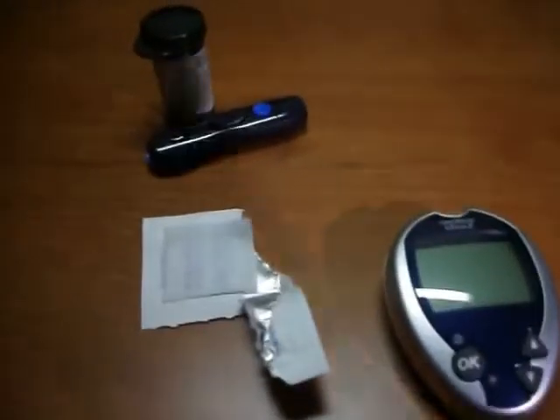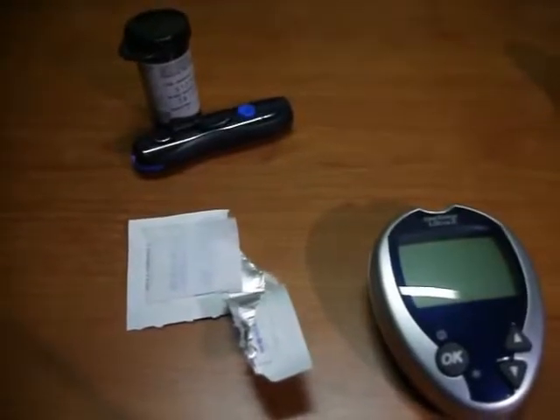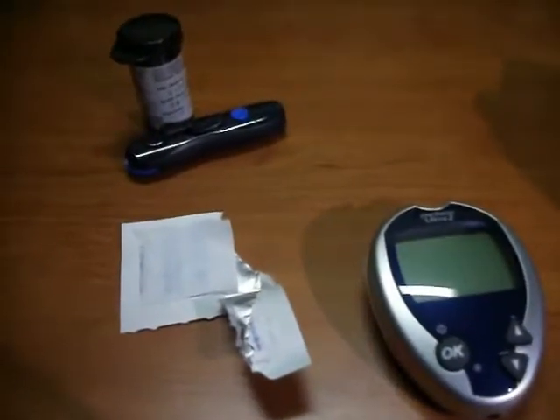Hi everyone, my name is Tania Malinovsky and I am here today to demonstrate the process of testing your glucose levels at home using an at-home system.